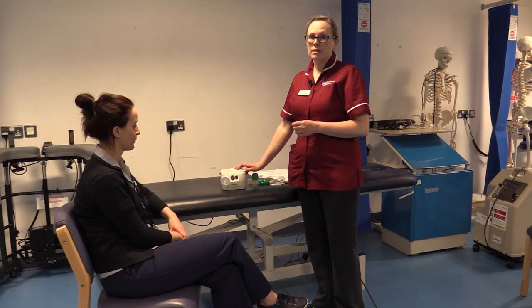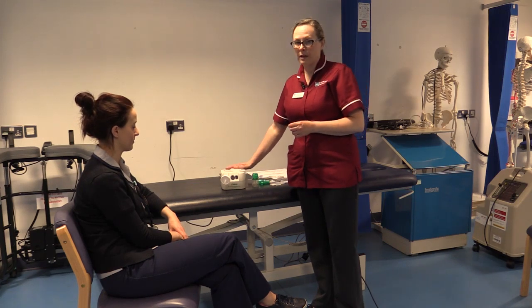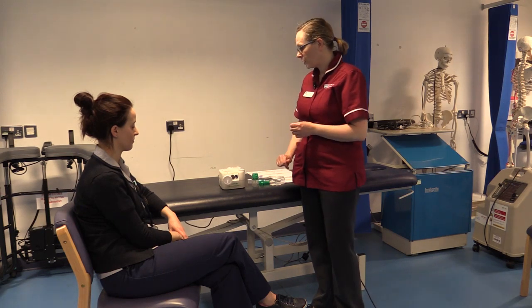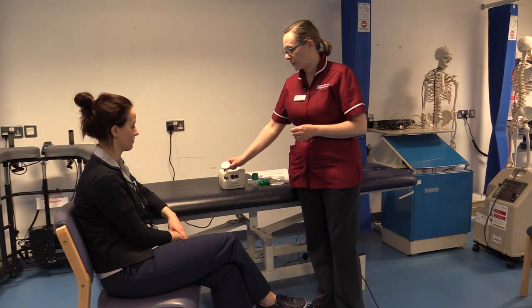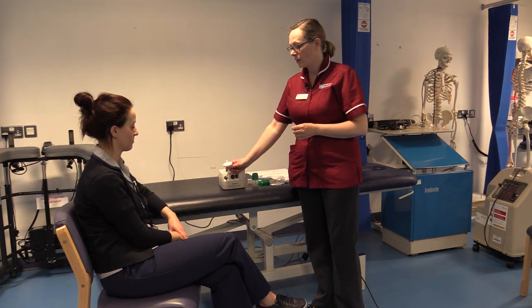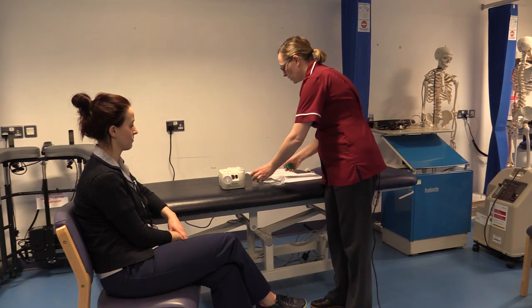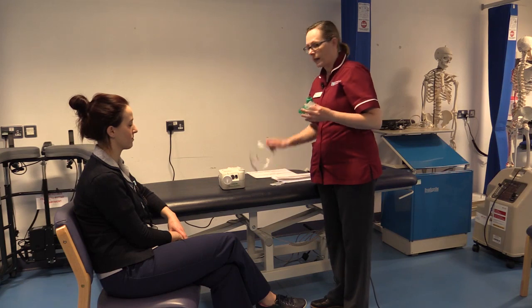Some patients will have their drugs administered via nebuliser. This is what a typical nebuliser looks like. There's quite a number of varieties of nebulizers. Those that are loaned by the Trust will be labelled and will have what we call a bacterial filter attached. Private nebulizers will not. The nebuliser will come in 3 parts: an acorn, a mouthpiece and a set of tubing.